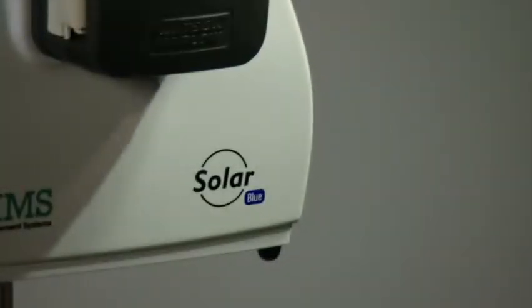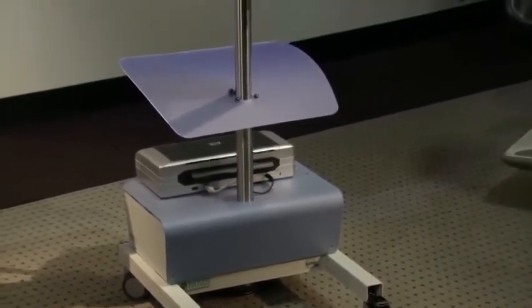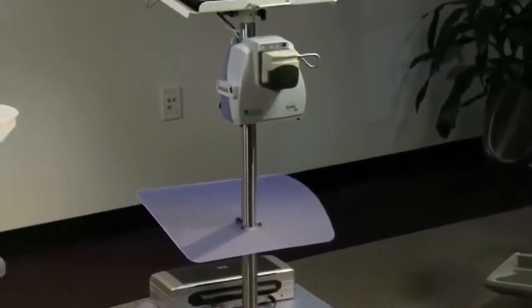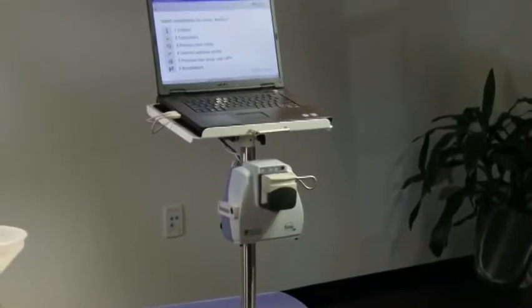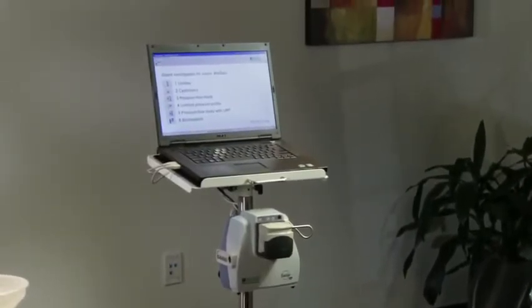Developed by Medical Measurement Systems, SolarBlue meets the latest International Continence Society's recommendations and uses state-of-the-art digital technology. As a result, the SolarBlue is very small, 100% wireless, and very easy to use.